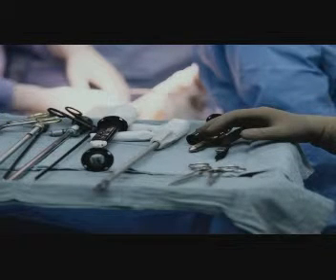Establishing a sterile field will be your responsibility. You'll check the provider's orders and the institution's policy to determine whether or not a procedure requires surgical asepsis. In many cases, the institution will have assembled packages designated for specific procedures and will have sterilized them. These packages contain the items commonly used for that particular procedure. Procedure-specific packages can also be purchased.